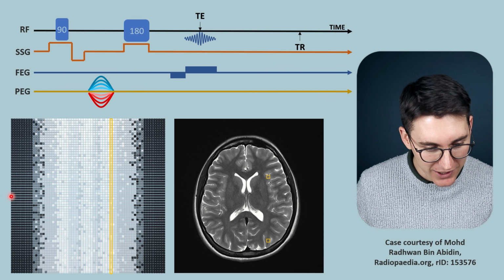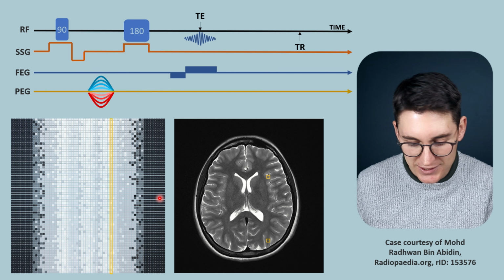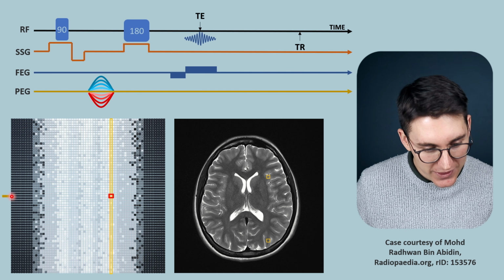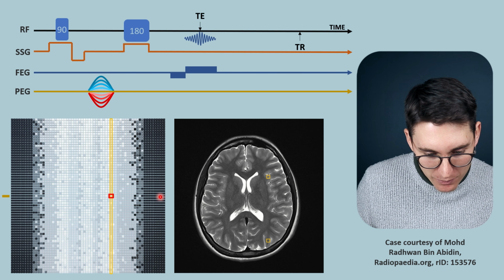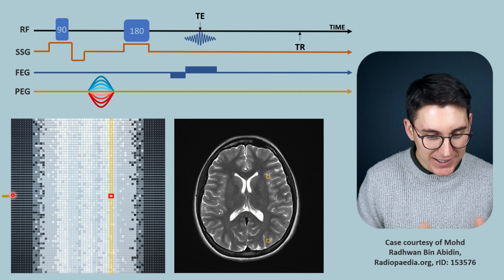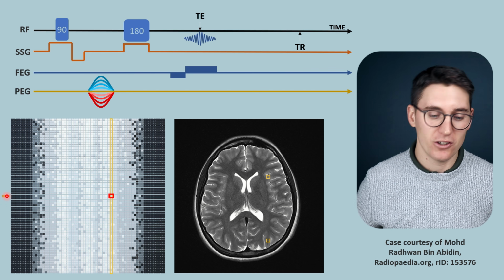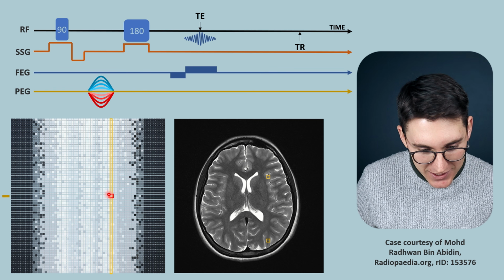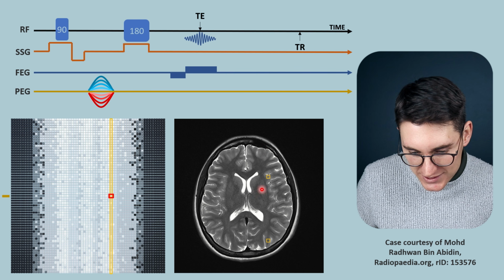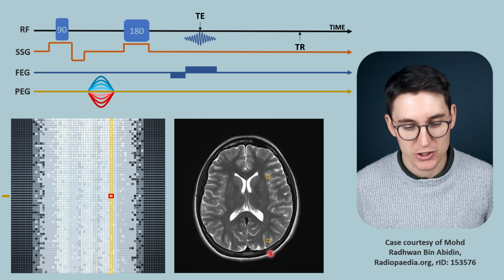So when we don't apply a phase encoding gradient, we know that we generate the frequency data at the center of this frequency data set here. This data set at this given point here represents all of the net magnetization vectors delineated into frequencies when we haven't applied any phase encoding along the y-axis. This particular data point here represents all of the signal coming from the x-axis column along our image.